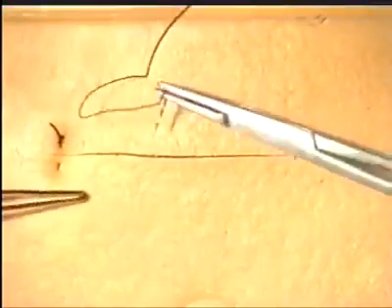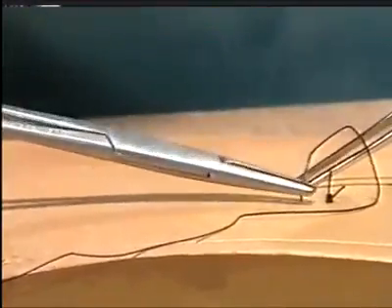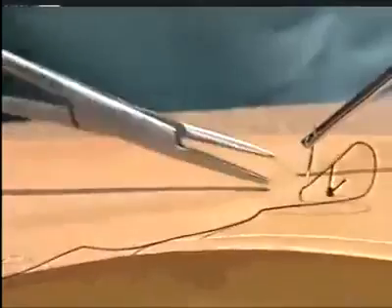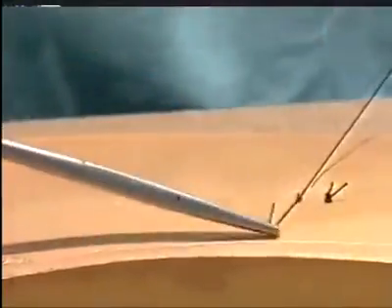A second vertical mattress suture is inserted. The suture is placed. The needle then reversed in the needle holder. And then go back, taking just a few millimeters of skin edges. The knot is then tied and the suture material cut.